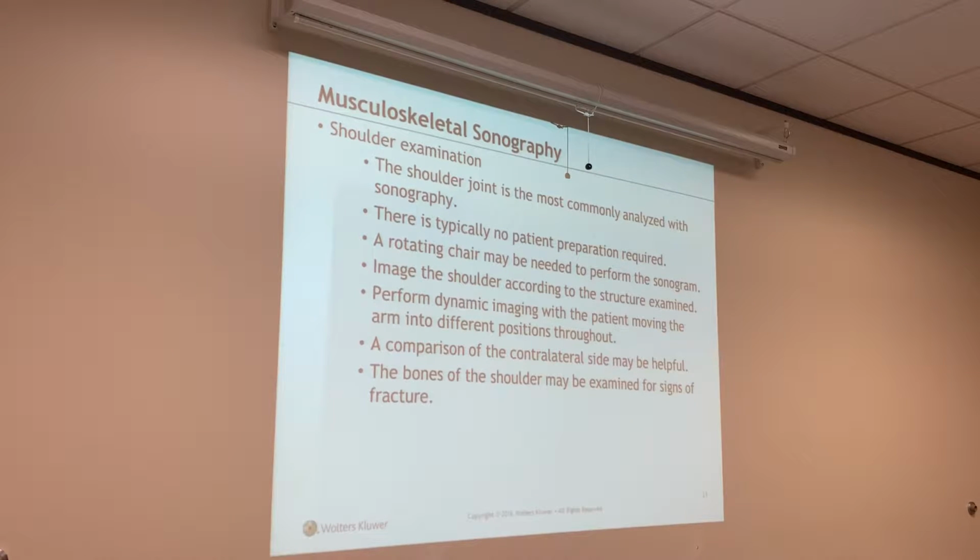Shoulder exam, never done one. There's no preparation. I don't have any experience with musculoskeletal. That is considered musculoskeletal. Anytime they look at my shoulder, my wrist, my elbow, my knees, my hips, my spine, my hips on babies that we do, those are all considered musculoskeletal. Okay? It's easier to do them sitting up than it is to lay down. There's special chairs that they can put you in for your knee to keep you stabilized so it doesn't move around.